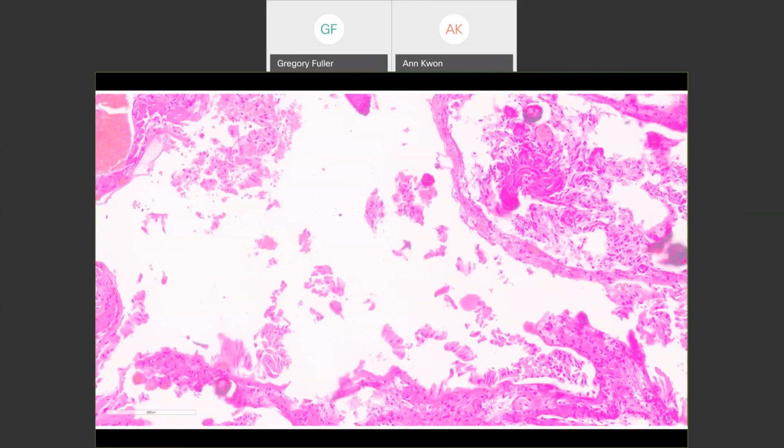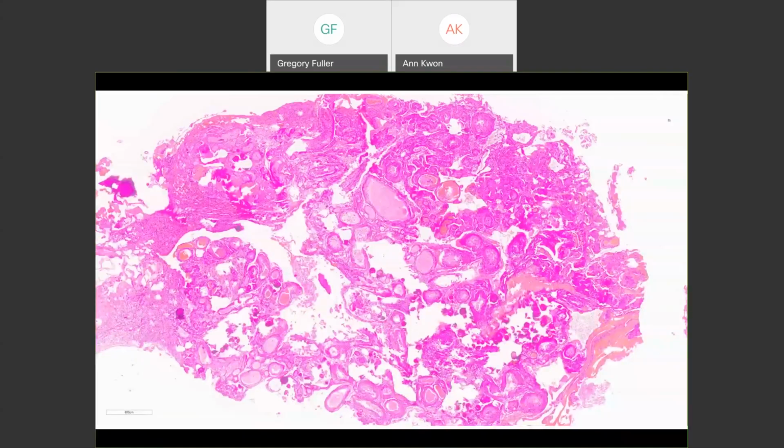What is it telling us? It's a surgical specimen. What it's telling us is that the lesion that the surgeon resected is either in or close to or involving the lateral ventricle. Now that's very important. All right, this is the whole mount of the surgical specimen. And again, what you see is all this dense tangle of vessels and the psammoma bodies, the calcifications.